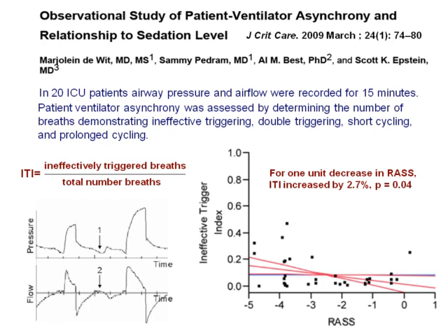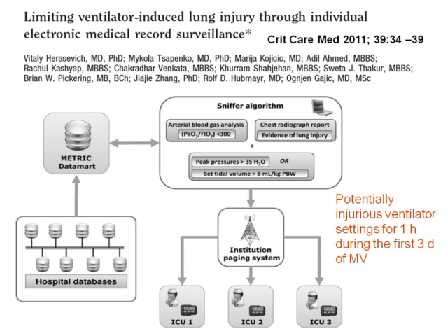Sedation, this has been mentioned. If we try to sedate to eliminate certain types of asynchronies, this might be good for double trigger, but this is not good in that case for missed triggers. You will see this paper of Marjolin DeWitt in this patient. So when the patients were more sedated, as you will see, the ineffective trigger index was high. And again, in order to save time, this has been very well explained by Laurent Brochard in the preceding talk. Now we have some tools to monitor at the bedside.